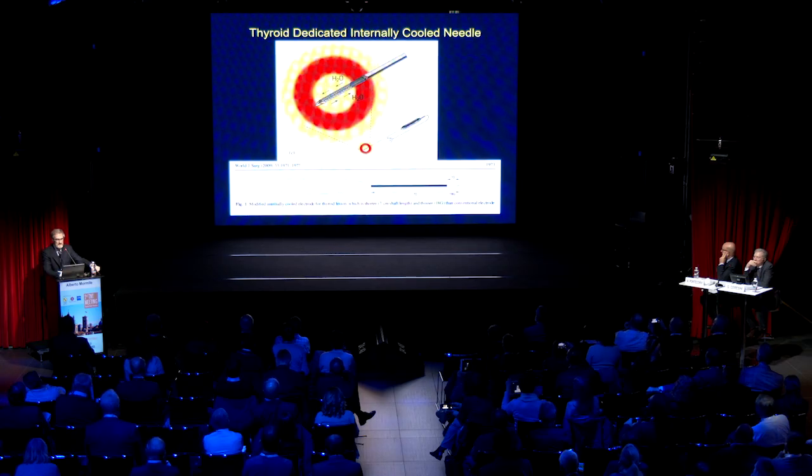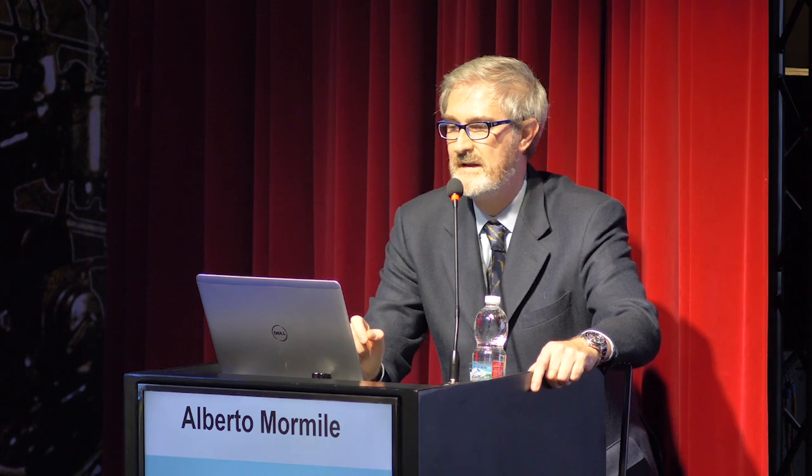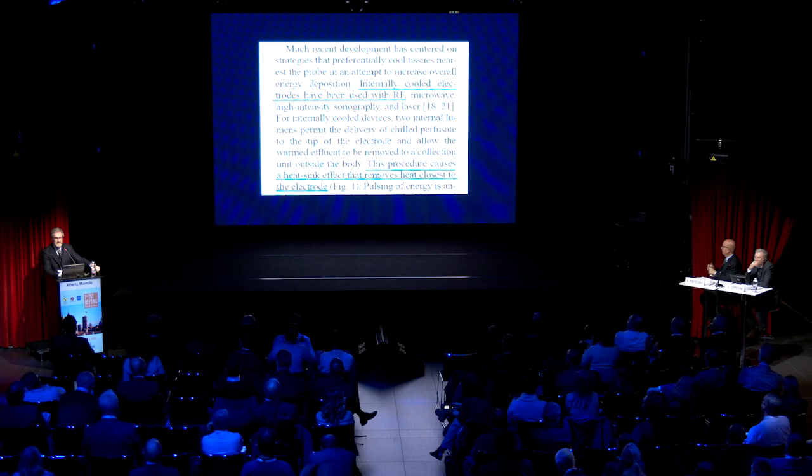Ten years ago, a thyroid-dedicated internally cooled needle was proposed by Dr. Beck. The needle is thin, the point of the needle is active, and inside the needle flows ice water moved by a pump. When the radiofrequency is switched on, only the point of the needle becomes active. This procedure causes a heat-sink effect that removes heat closest to the electrode.